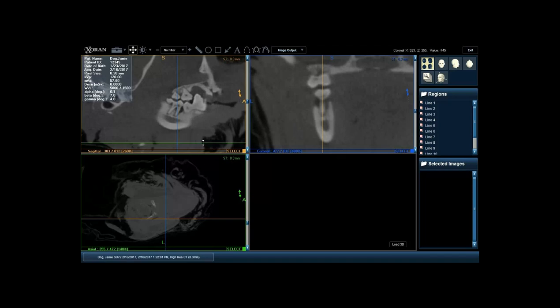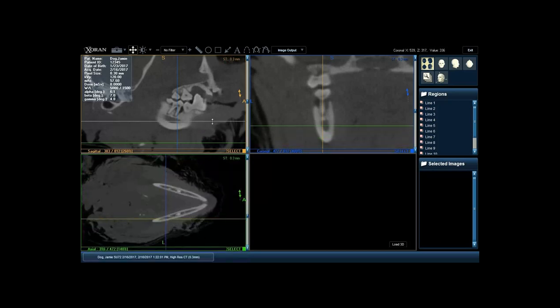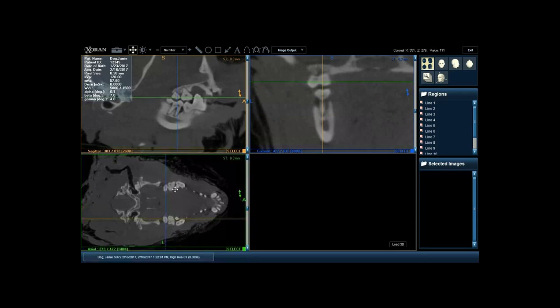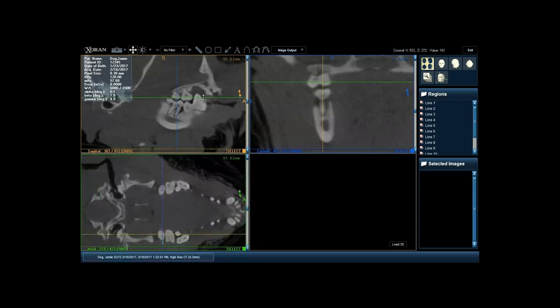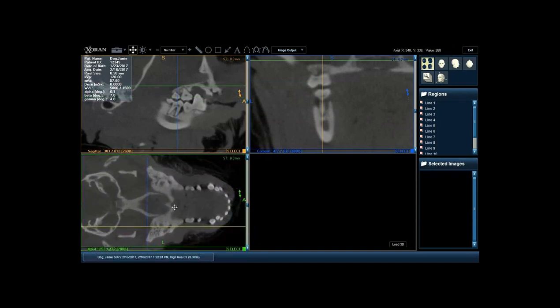Looking at the axial view - again starting on the ventral border of the mandible, those tooth roots appear and we're able to identify location and variation of all of them. Looking at normal occlusion in this view, we're able to see where those teeth come together from the mandible and maxilla, and see the location of all those tooth roots. Endodontic lesions show up very nicely on axial views - you're able to see a lucency completely around the roots.